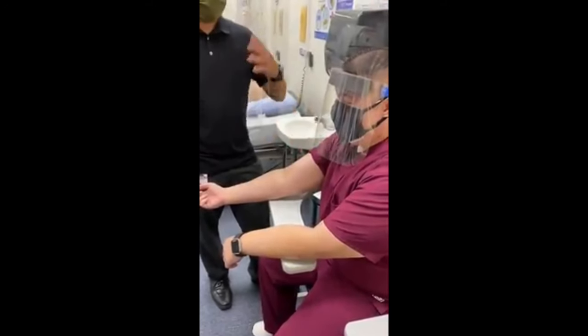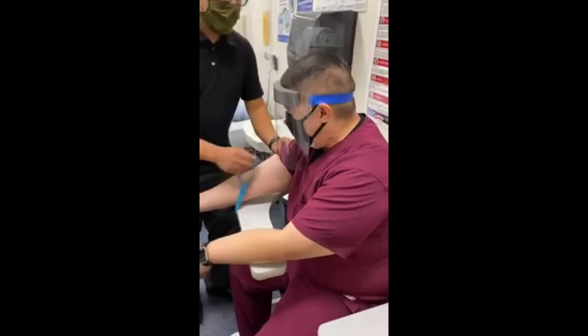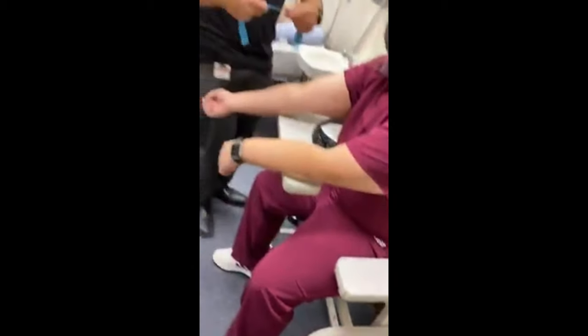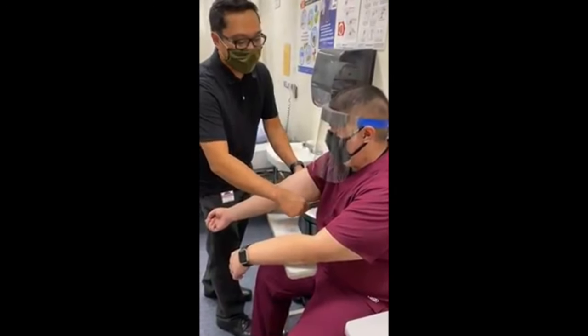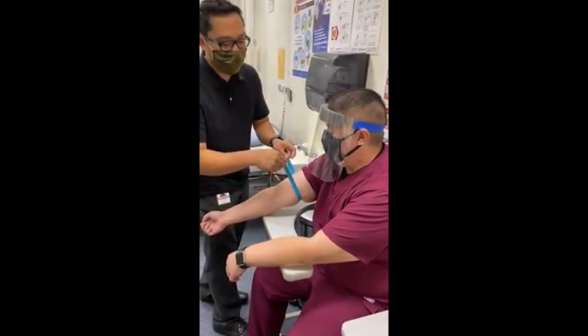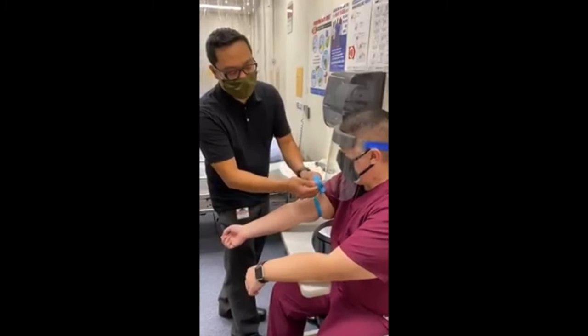In this case I'm already assessing Ryan once he comes in. He has tight skin. So when I wrap the tourniquet, underneath the arm here, once I place it underneath, I'm going to start stretching it, pull up 3 to 4 inches, and hold it like this.